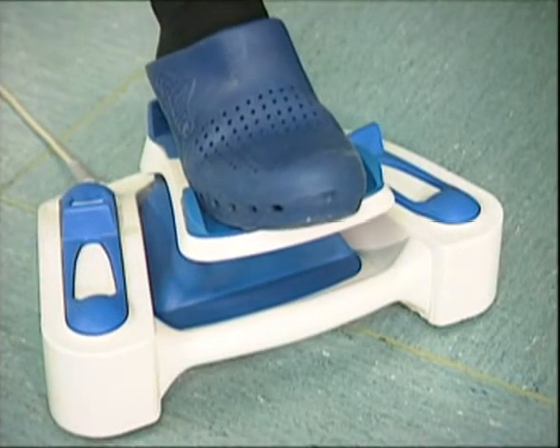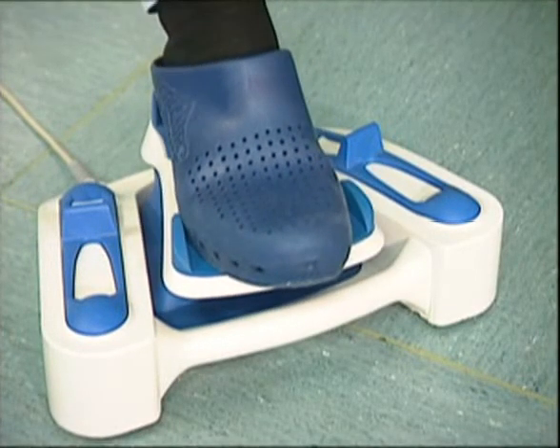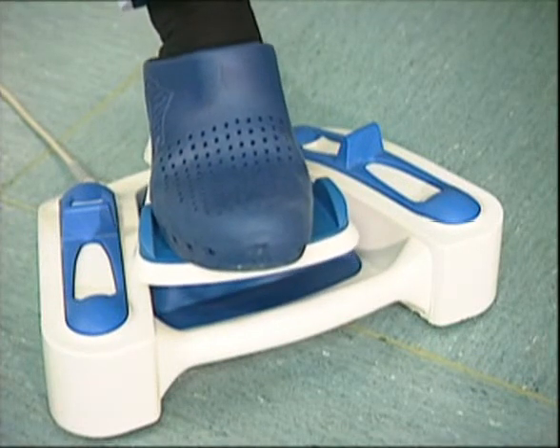Of course, this can only be made by using vitrectomy machines which allow simultaneous cutting rate and aspiration flow control with a specially adapted foot pedal.